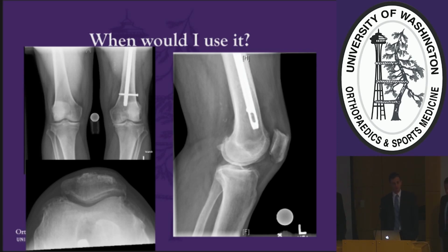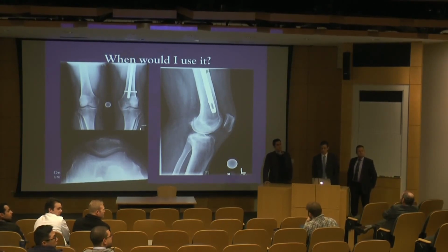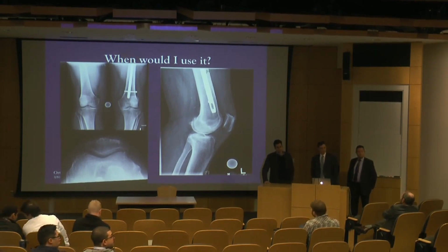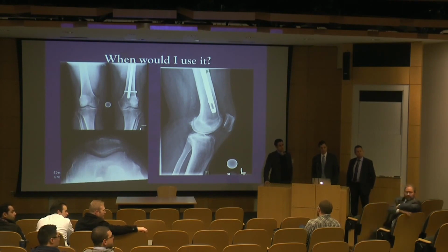Great presentation. I think one thing that you both mentioned is that in cases of deformity, navigation, whether it's computer navigation or pre-navigation with PSI, can be helpful. But with the knee, assuming that you have a set soft tissue compliance of a given knee, the collateral ligaments especially, what are your guidelines on accepting whether you're going to be able to correct deformity through the knee with your implant position versus extra-articular correction of the deformity through osteotomy? So what are your guidelines?